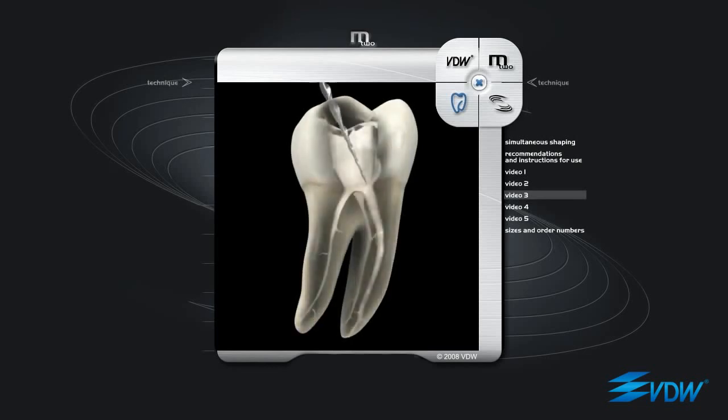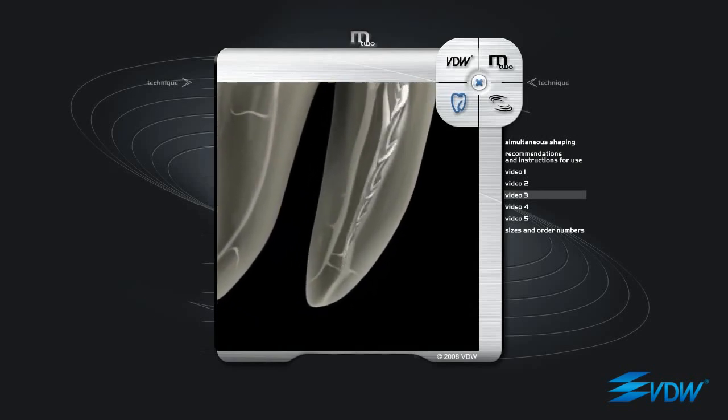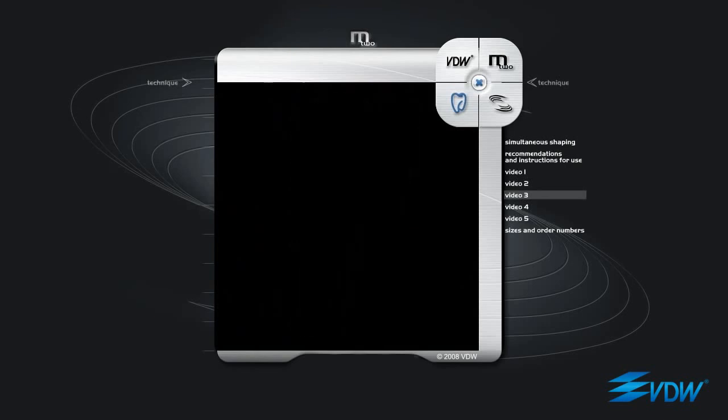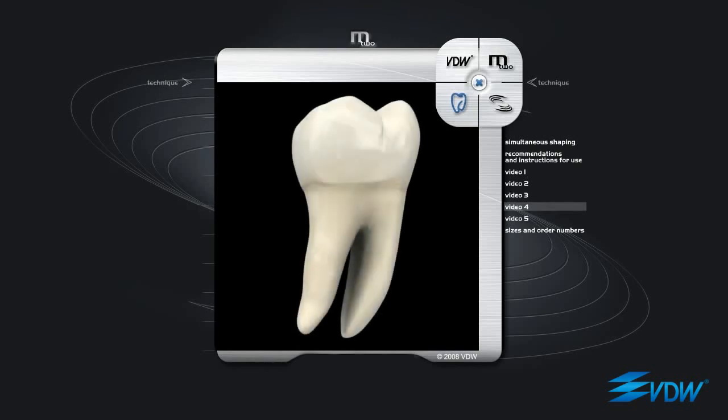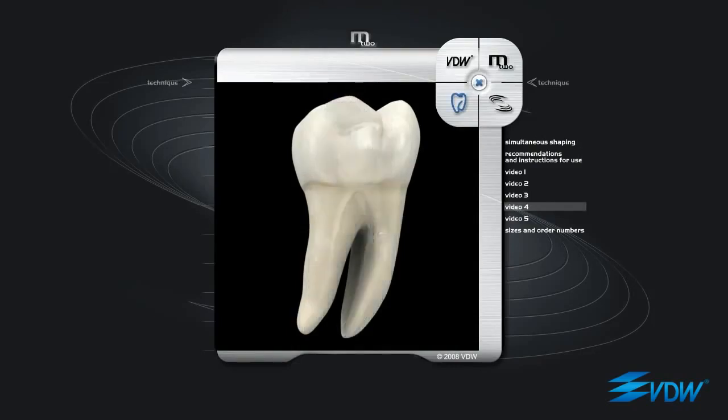Even with the third instrument in the sequence, there is an increase in both tip diameter and taper. This is an ISO 20 taper 06. It is inserted into the path made by the previous instruments. Here, filing is required only when the tip is a few millimeters from the apex. The fourth and last instrument is an ISO 25 taper 06 — very effective and flexible, able to reach full working length even in curved canals without altering the apical anatomy. Every instrument reaches the apex with conical and coronal widening using passive filing if required. This technique is called simultaneous shaping.